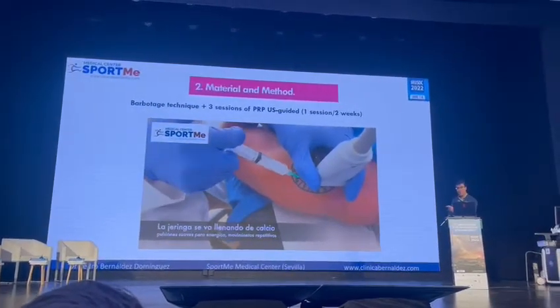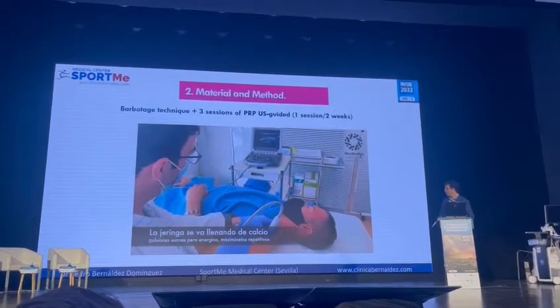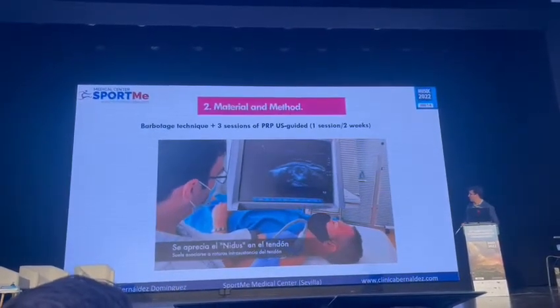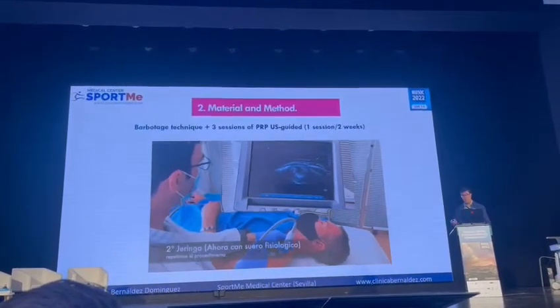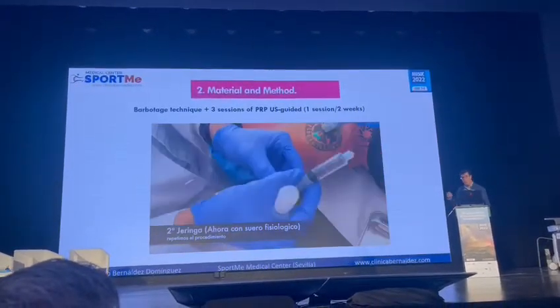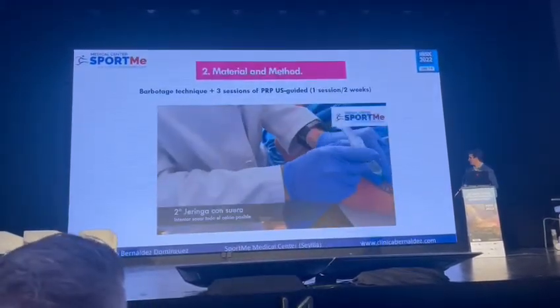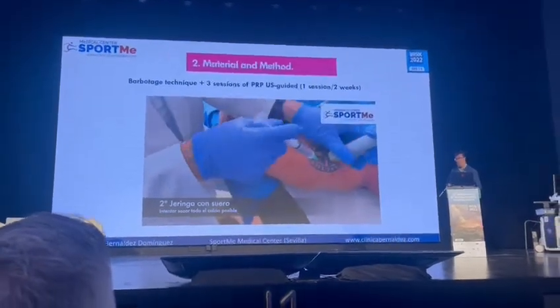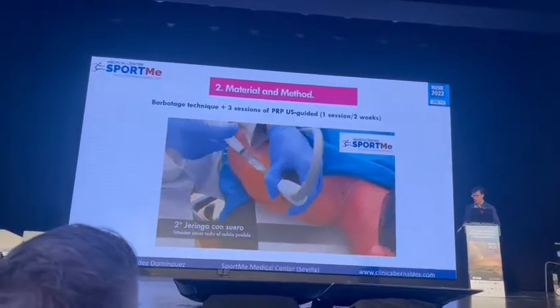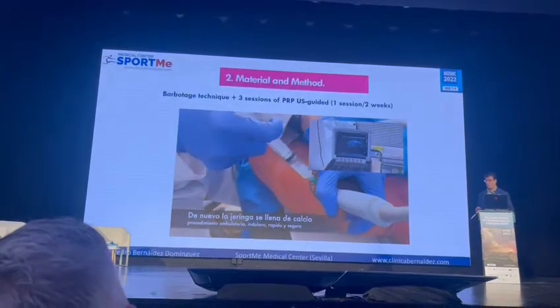We start softly, gently, we push, and then we start to see the syringe filling with the calcium deposit, and then we start to see the lesion, the rotator cuff tear, because we think this is a real tear of the rotator cuff, and then we start to remove all the calcium. It depends on the Gartner classification, obviously. And then, when we see all the resorption, we have to be careful not to extract the hydroxyapatite calcium deposit into the bursa, because the bursitis will be painful later.